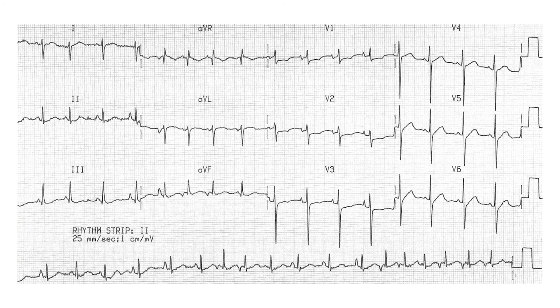Another example: you can see that persistent S wave — that negative deflection — throughout the precordium. V1 is upright, which should key you in to an abnormality because V1 is supposed to be negative. This is another patient with clear pulmonary disease and RV enlargement. Not only do you have that persistent S wave indicating rotation of the heart, but looking at the limb leads, the QRS is most positive in lead III — right axis deviation. Then V1 shows a positive wave when it shouldn't, and those two things together indicate the RV is generating extra electricity, indicating either acute RV strain or RV hypertrophy. In this patient pre-diagnosed with end-stage COPD, we can assume that is their normal ECG presentation with a hypertrophic right ventricle.